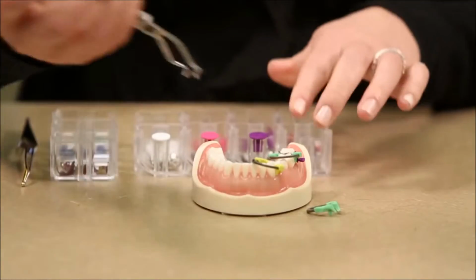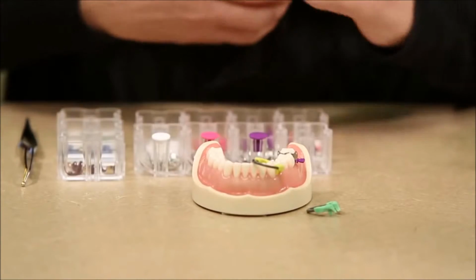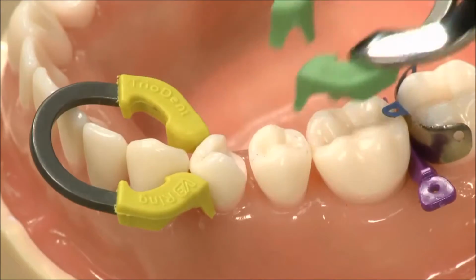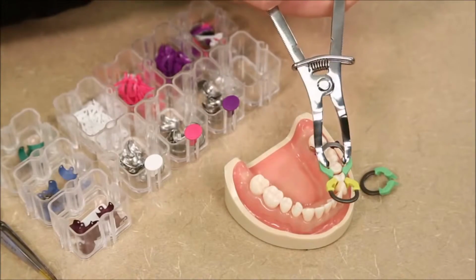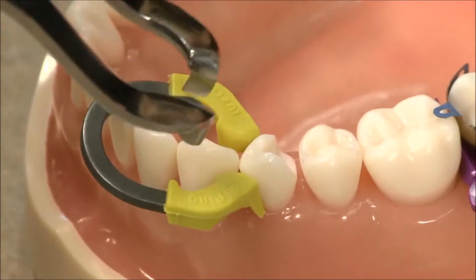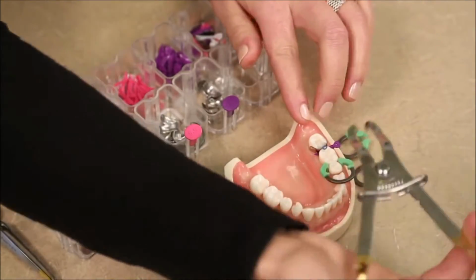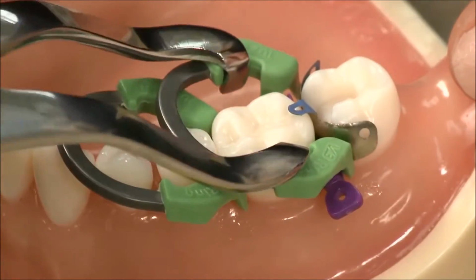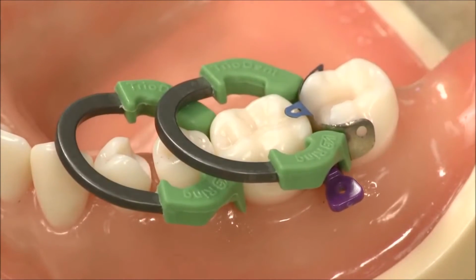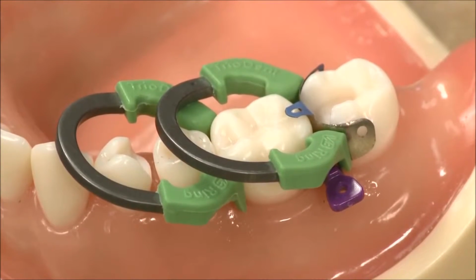If you would like to do an MOD on that bicuspid, you can actually turn the ring around and do what we would call butterflying and place that on in that direction. Alternatively, if you're doing quadrant dentistry or an MOD on one of your molars, you'll place the forward ring first, and then you can actually stack these rings on top of each other, which is nice. You don't have to have a short and a long ring. They're the same height, but because of the angle that we have in these rings, they're able to be stacked.